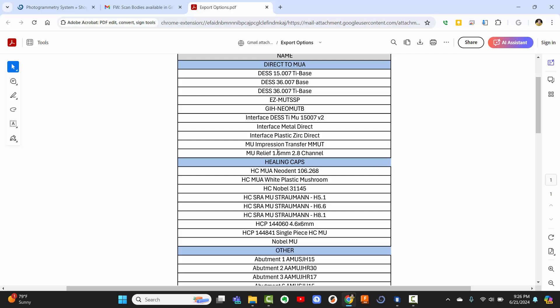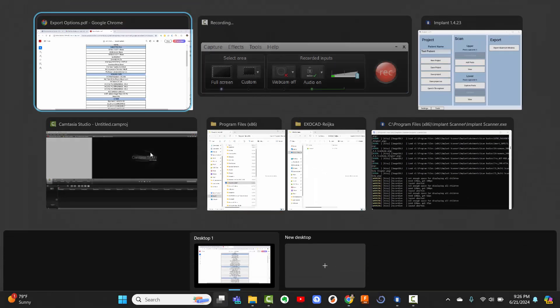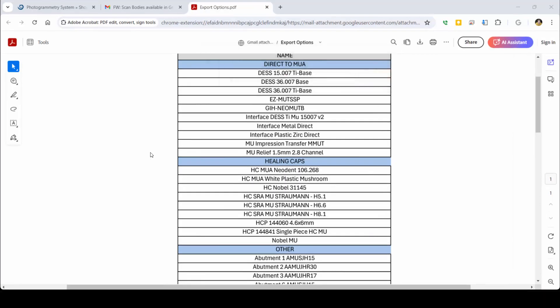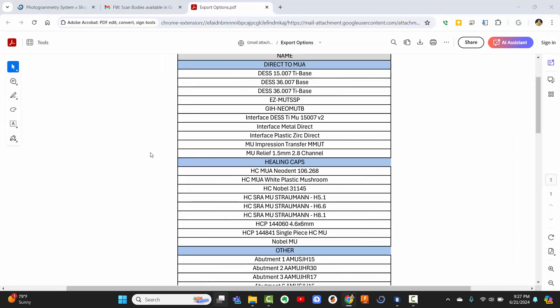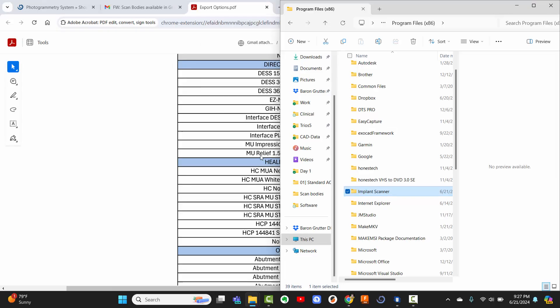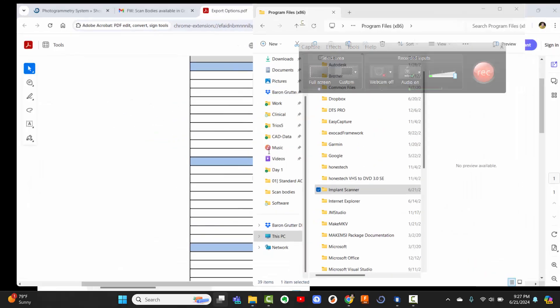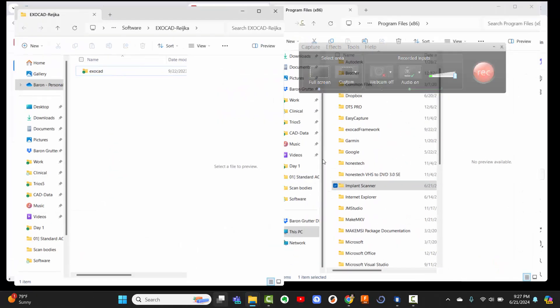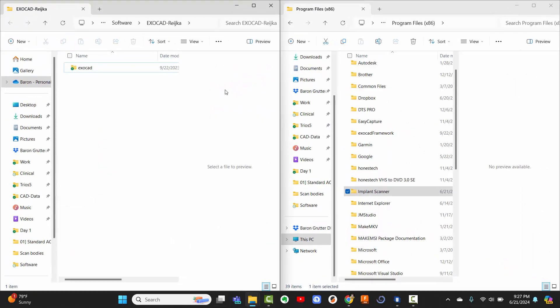However, what if you have a scan body that isn't in the list? How can you add that? So that's what this video is going to show you, and it's extremely easy. So let me show you. Alright.